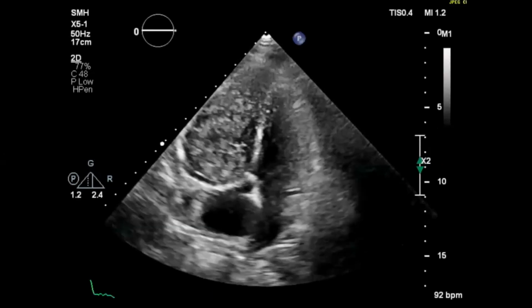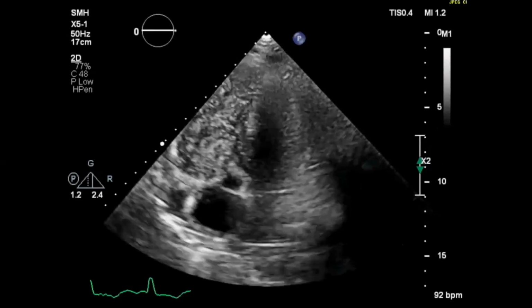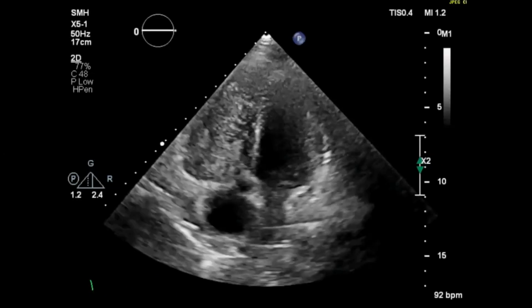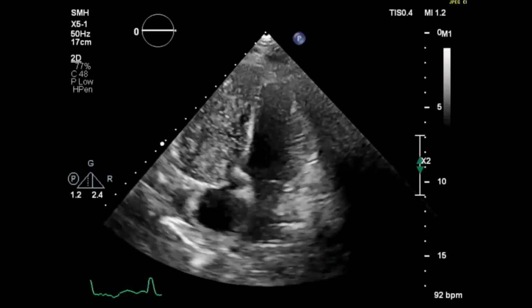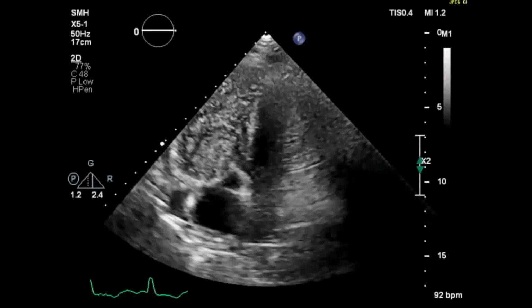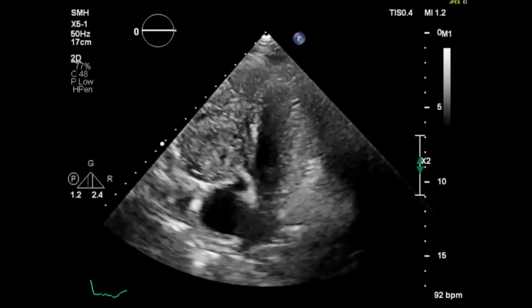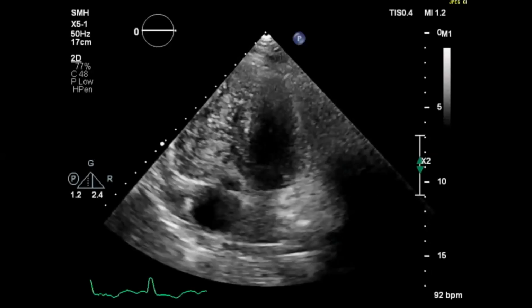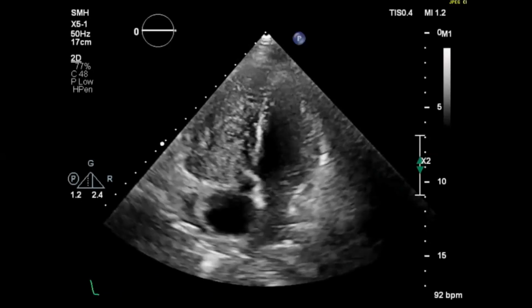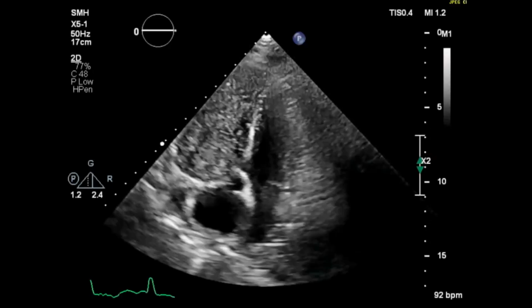So versus tumor. Yeah, this was a lady with a known history of osteosarcoma, had a previous below-knee amputation, and presented with this mass in the right ventricle in the context of recurrence. There were other views. Unfortunately, the quality wasn't that good, but it shows there wasn't really any flow acceleration across the RVOT, so it was not completely obstructing the right ventricle.